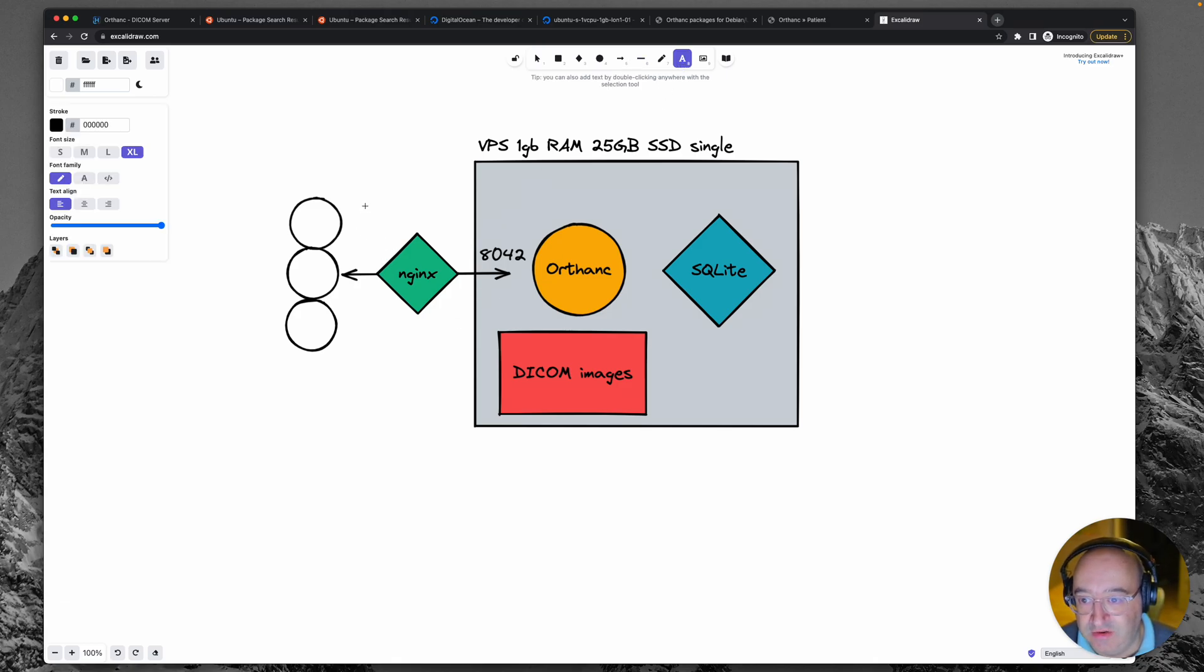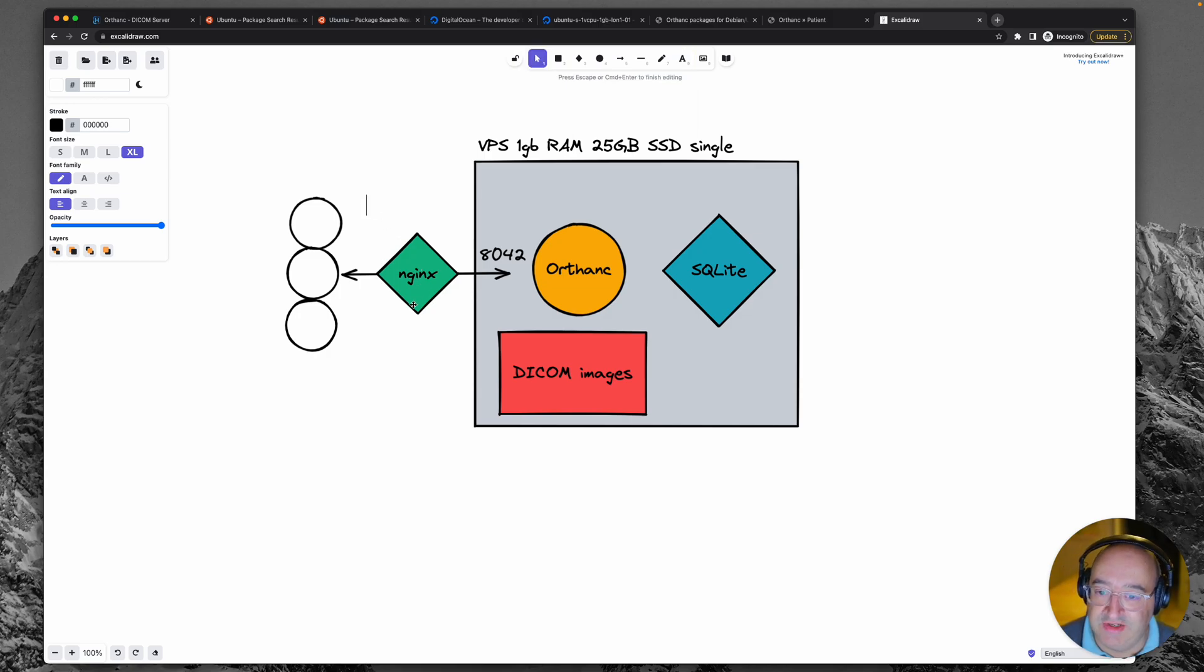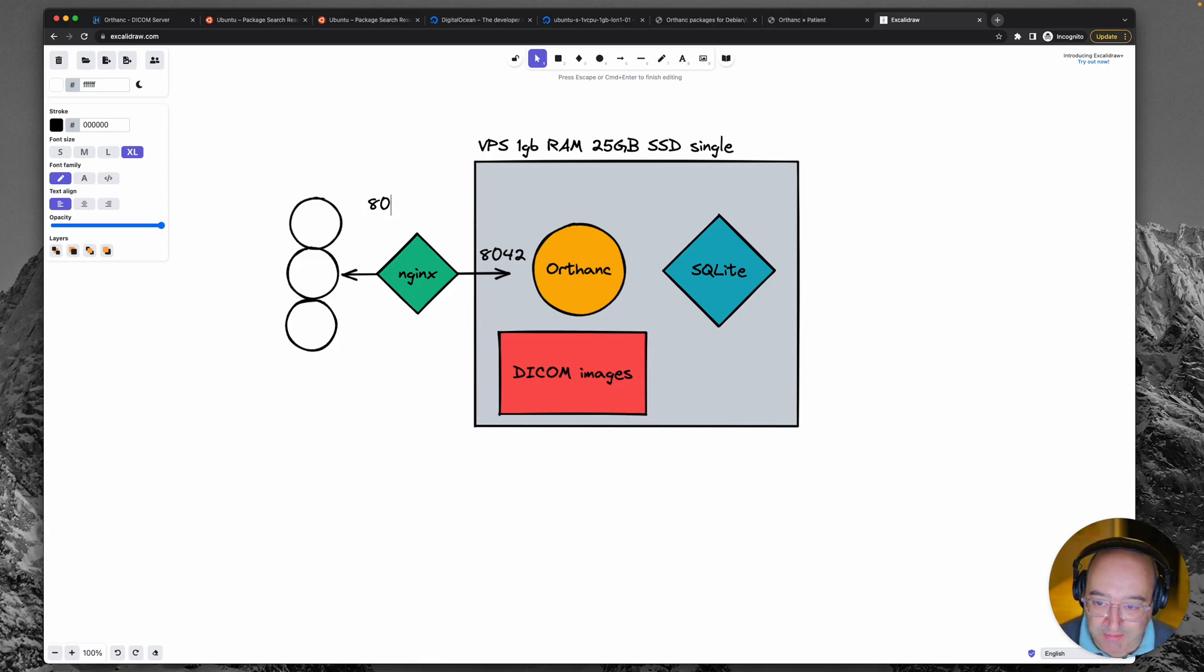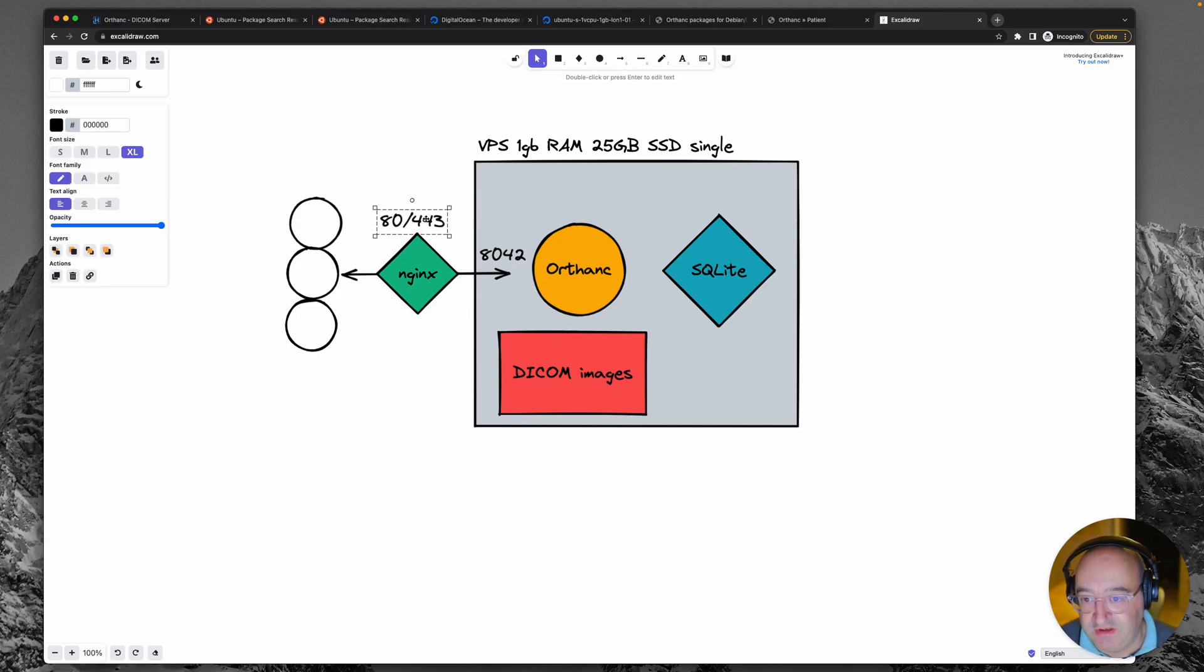Now we don't want to use this port 8042 because that is unconventional. We're going to use a more common web port such as 80 or 443. And we'll just put those there for now.